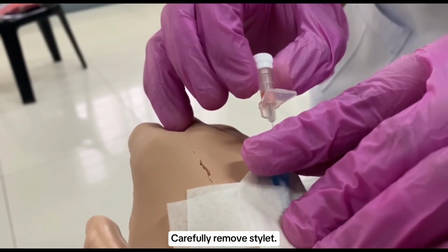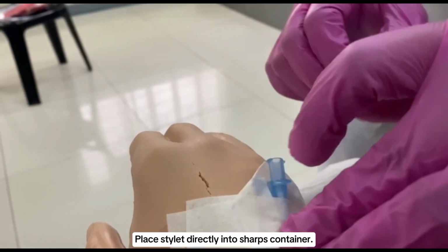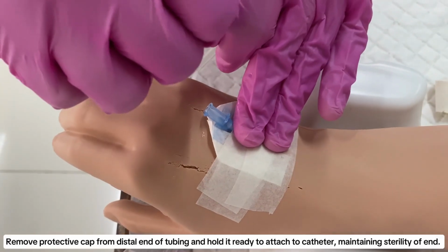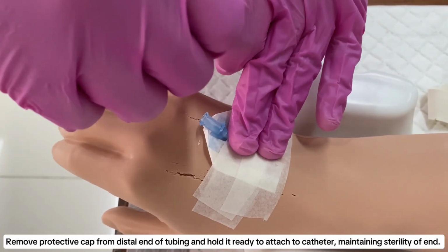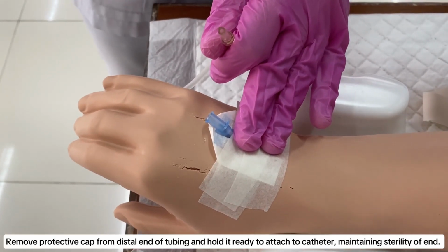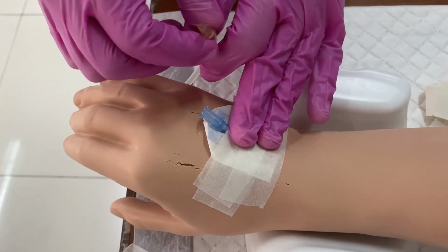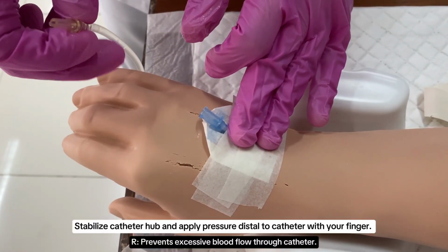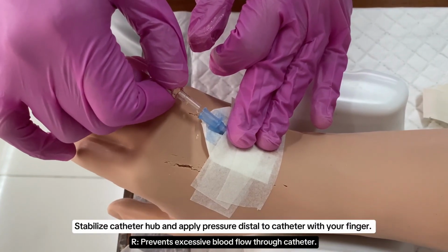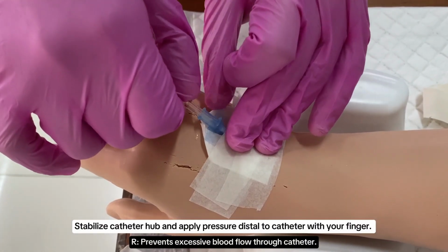Carefully remove the stylet, then place the stylet directly into the sharps container. Remove the protective cap from the distal end of the tubing and hold it ready to attach to the catheter, maintaining sterility of the end. Stabilize the catheter hub and apply pressure distal to the catheter using your finger. It prevents excessive blood flow through the catheter.